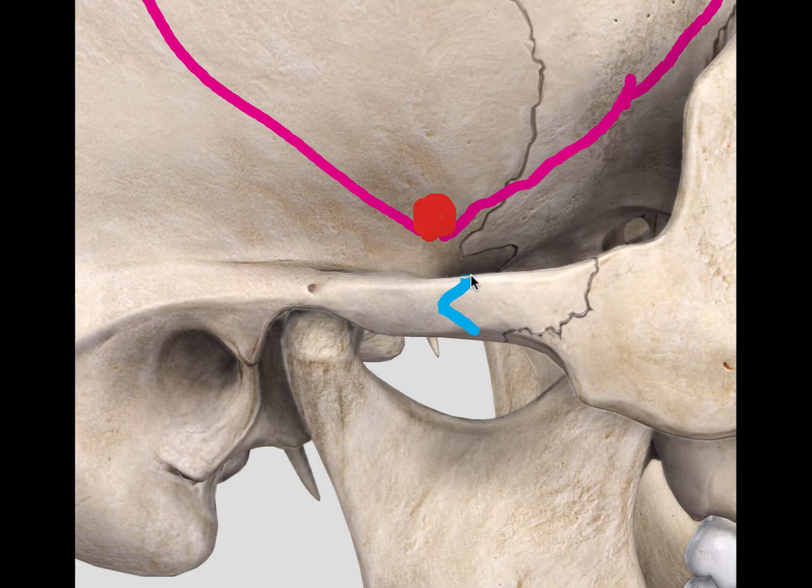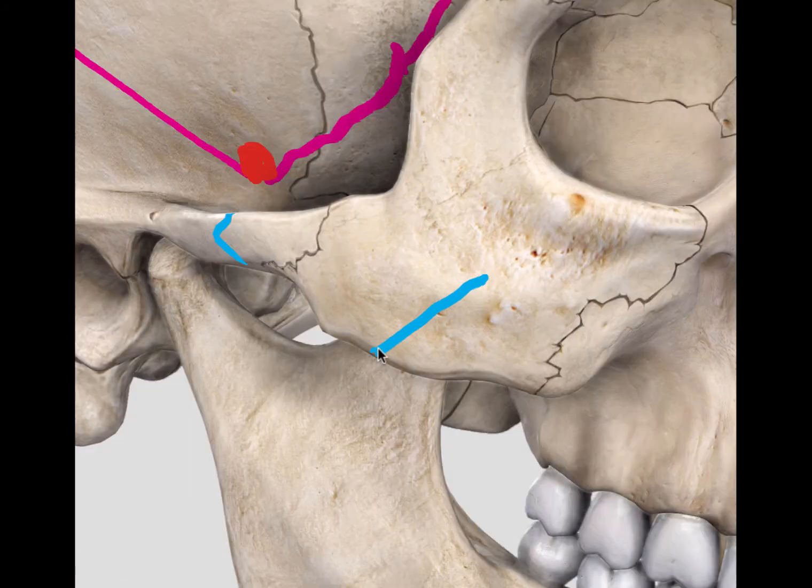The cut at the zygomatic arch could be achieved in different ways. One of them is to achieve it in two perpendicular cuts. This creates a notch, and this allows more secure fixing of the zygomatic arch back together with plates at the end of the operation.